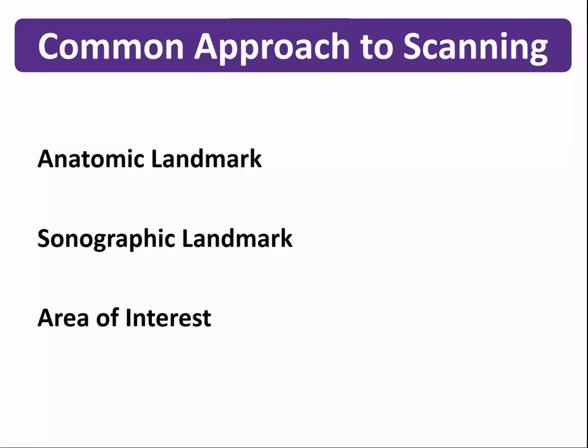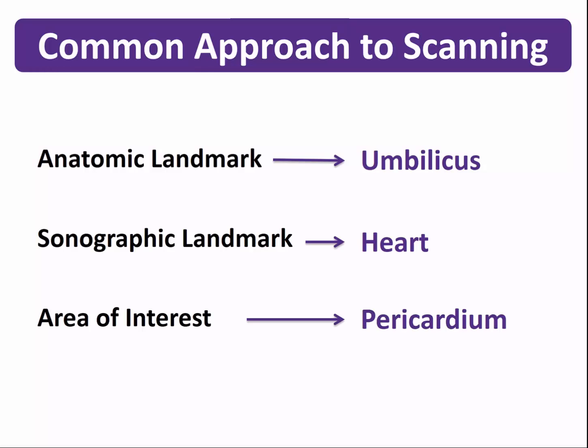Remember, the anatomic landmark in this type of cardiac study is the umbilicus. The sonographic landmark is the heart, and the area of interest is the pericardium.